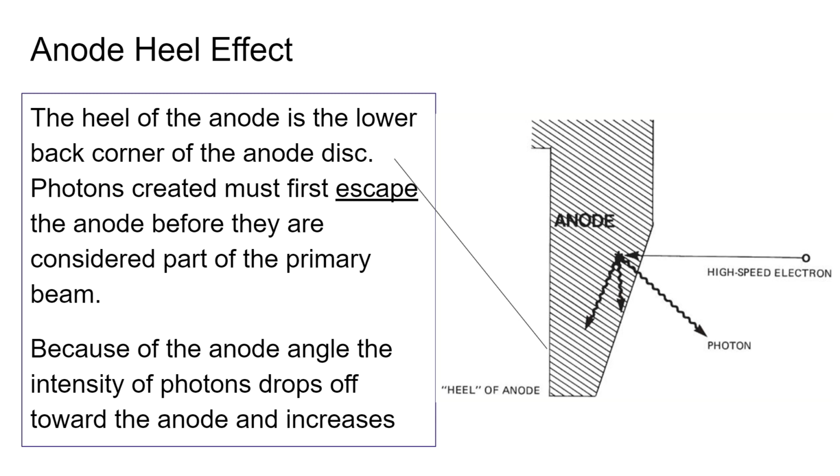In reality, when we say cathode and anode side, though, it's really kind of like if this is our patient on this table here and their head is to my left, where let's say the anode is on this side, literally cephalically towards the head, you have less radiation, and towards the feet, if this is the cathode side, you have more radiation. And that's how you want to place your patient too, right? Because unless they're all messed up, people get thicker as you go down, right? So that's the definition, that you have higher intensity on the cathode side, lower intensity on the anode side.